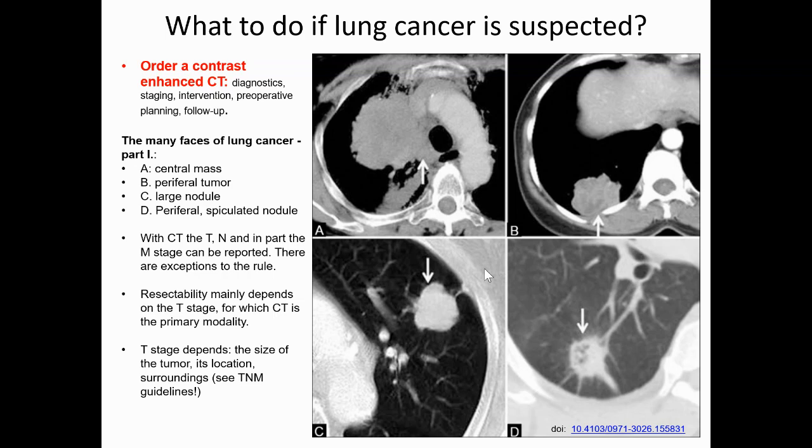Because if you do not give the patient contrast, then a lesion and the heart or the great vessels next to it would be the same color, and you couldn't differentiate the cancer, you couldn't measure the cancer, so that would be a useless examination.